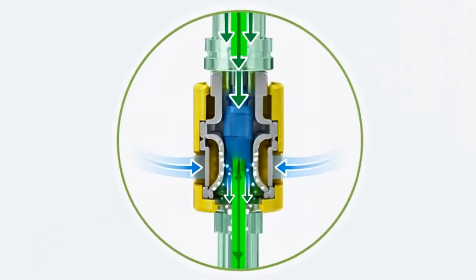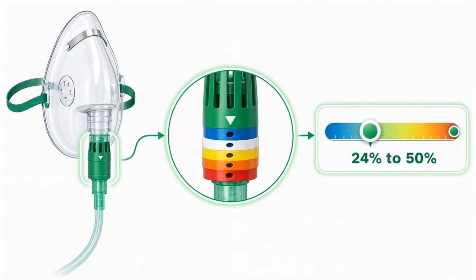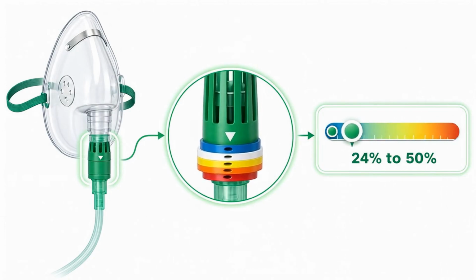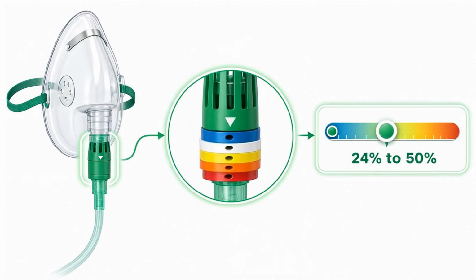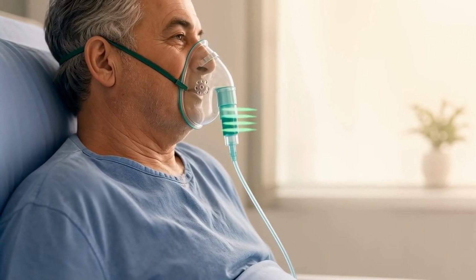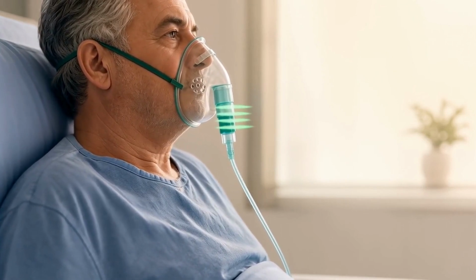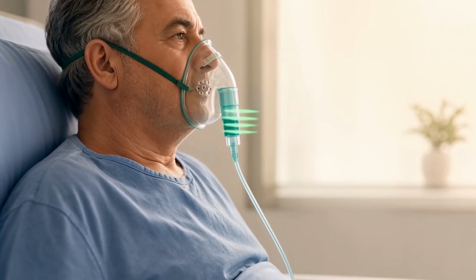This device is unique because it delivers a very precise, controlled oxygen concentration to the patient. It can provide oxygen levels ranging from 24 to 50%, depending on the specific adapter or setting used by the nurse. This precision is especially important for patients with COPD. These individuals are often sensitive to excessive oxygen levels in their blood.